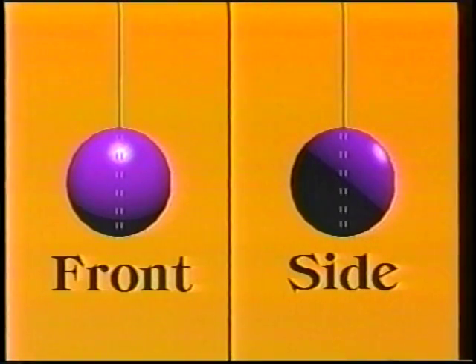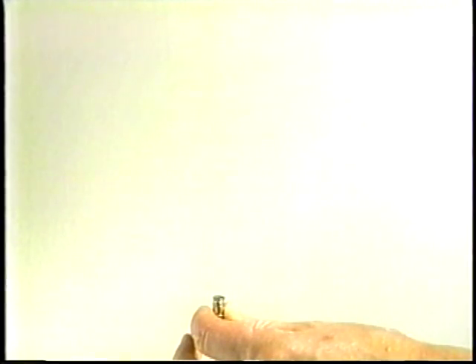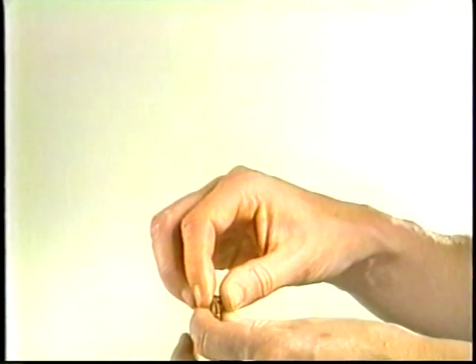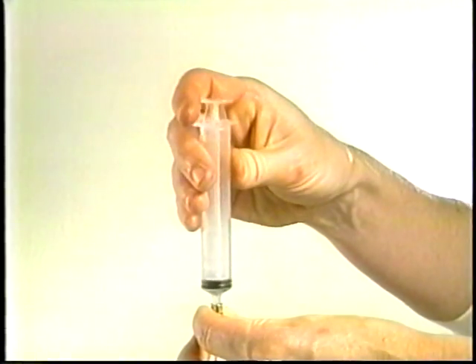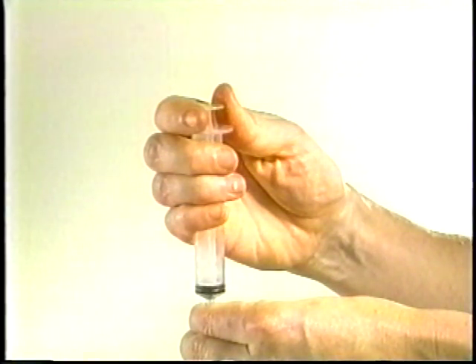The needle needs to be placed well within the target and in a position so that when the needle is moved back and forth, it will stay inside the target. If the needle is shown barely within the target, and especially if it is placed in a close to tangential position, the yield is likely to be poor. Once the needle is confirmed in a good position, the stylet is removed and the syringe is attached. A syringe holder is usually not needed. Instead, the syringe may be held like this.